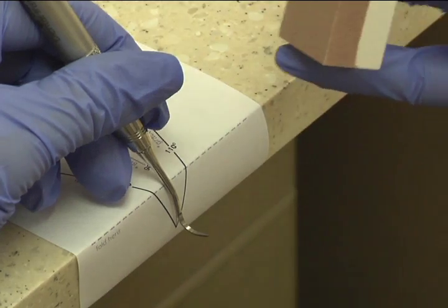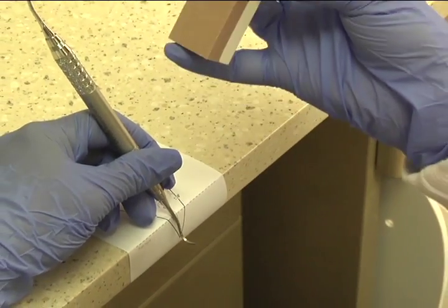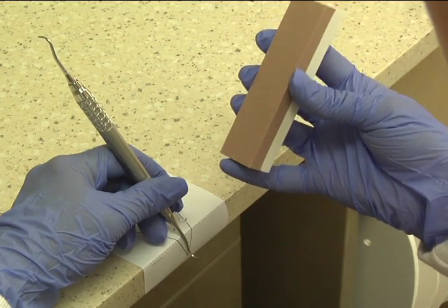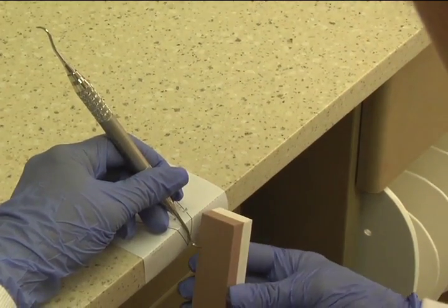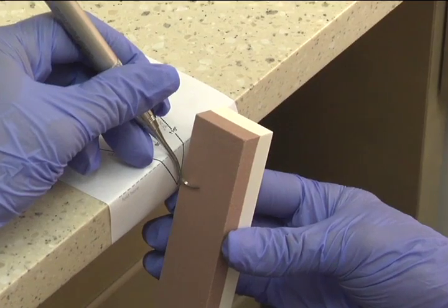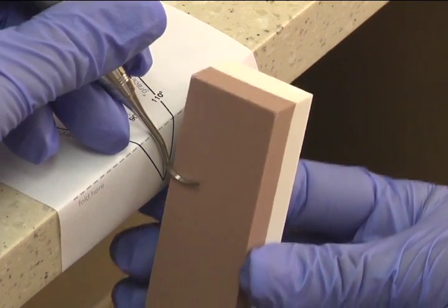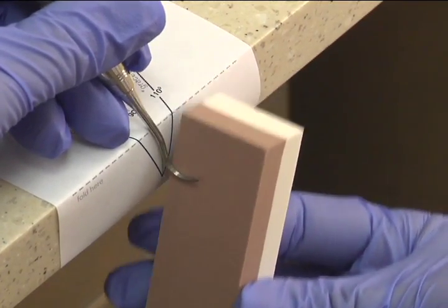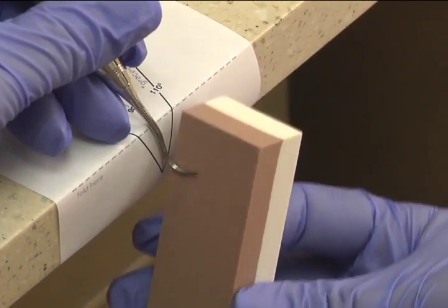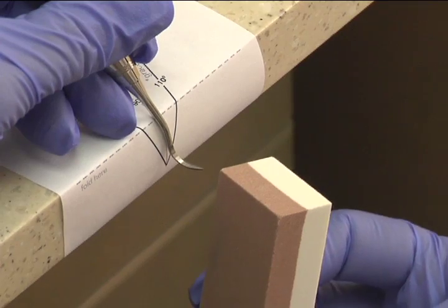And I'll hold the stone with my thumb on one side of the stone and my four fingers on the other. And sometimes, if you feel more comfortable, you can have the stone with your pinky underneath to stabilize. So with the H67, it has a bit of a flame shape. So what you want to do, I don't want to just stick to the 110 here. I want to tuck in a little bit, and I'm going to apply heavier pressure going down, lighter pressure coming up. And I'm doing the back, middle, and the toe, ending it on the toe.